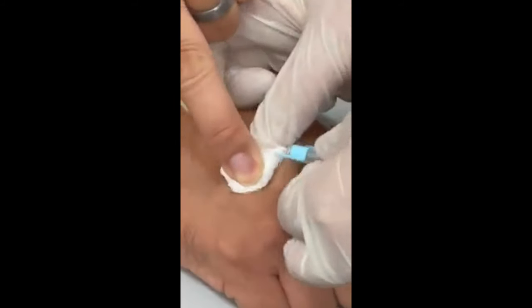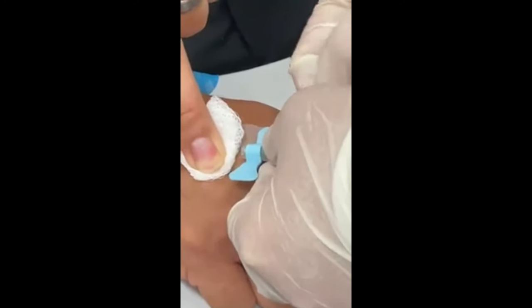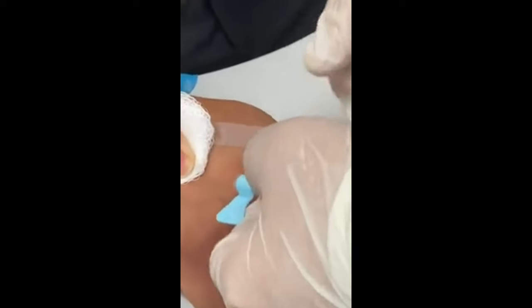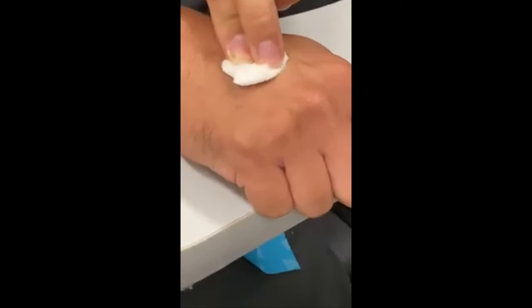All right, and then what do you do with that needle? Can I pull it out? Yeah, you can pull the whole thing out. And then the tape too. Or you can even use that to tape the gauze later, so either way is fine. I'll just put this aside. Yeah, that's fine.